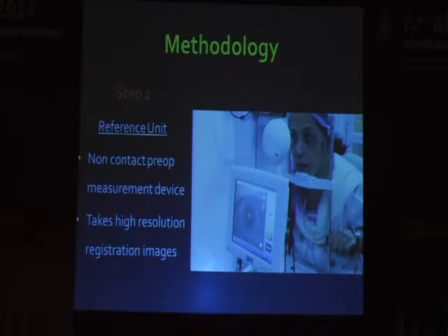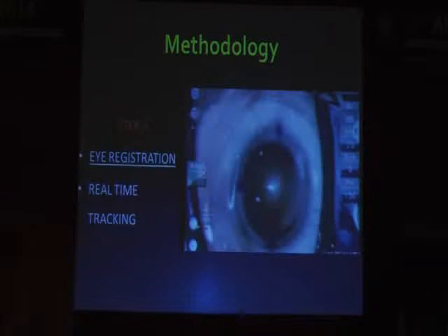After which, the patient was taken to the reference unit. This is a unit of SMI, a non-contact measurement device which took high-resolution images of the cornea. Then these registered images were matched with the microscopic images. There's a video here.